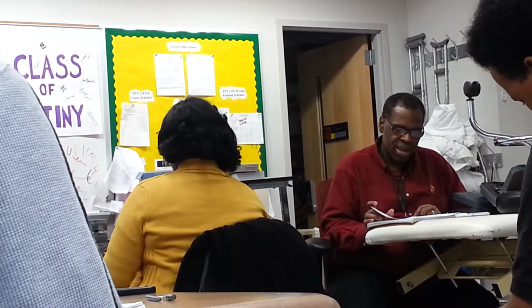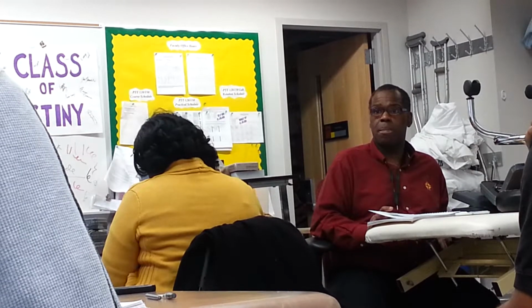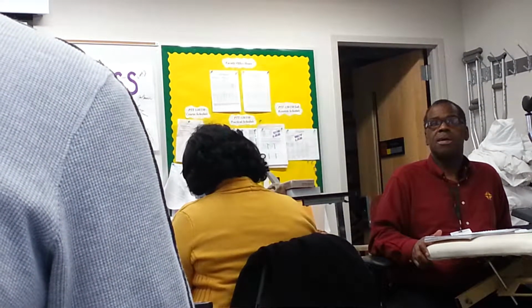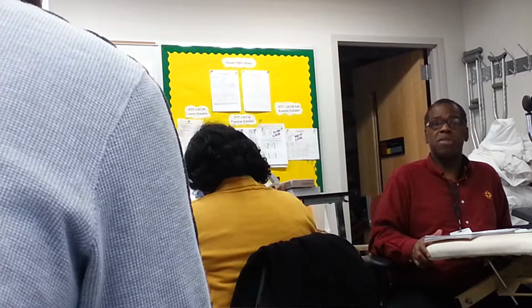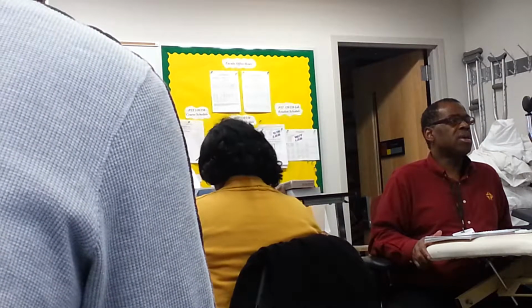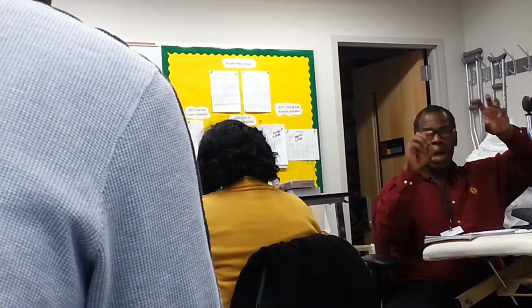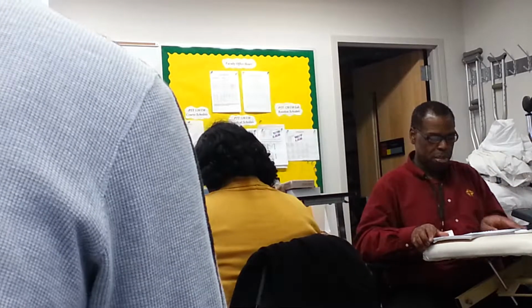All right, so at the bottom of page 28, it has bipolar setup. How many bipolar setups do you see on page 28? Two. What's the rule for bipolar setup? What does bipolar mean versus monopolar? It's two pads, two active. Dispersive and active is mono. Okay, give me the rule about dispersive and active. So monopolar means an active and dispersive. Monopolar also means a smaller pad and a much larger pad, or one pad that's more than twice the size. Bipolar means active and active, but bipolar also means two same size pads, or close to the same size.